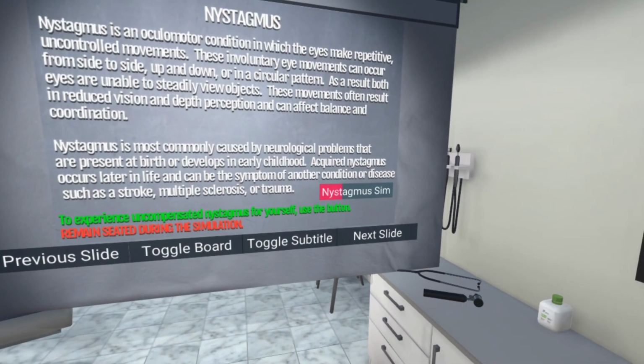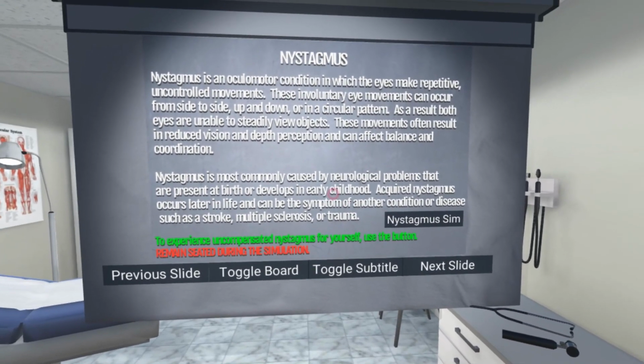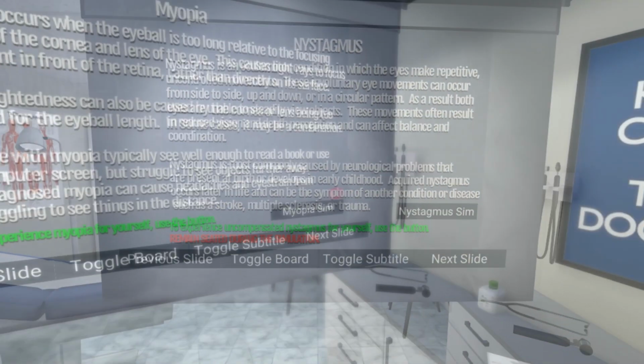Our device actually tests their balance control by comparing their visual, their vestibular, and their somatosensory inputs to see how well they can keep their balance under various conditions. And this gives us an idea of specifically what might be underlying the balance disorder that they're experiencing.